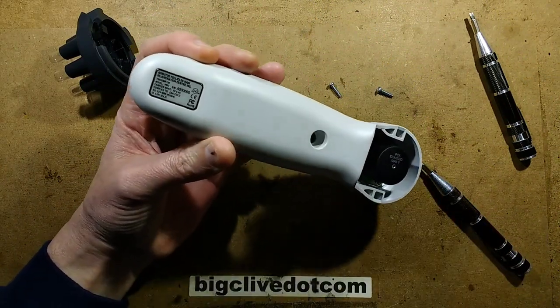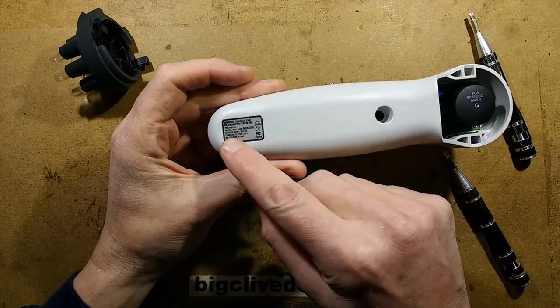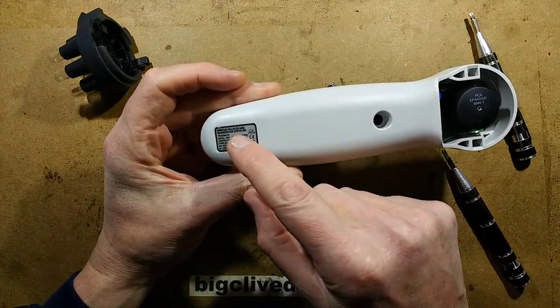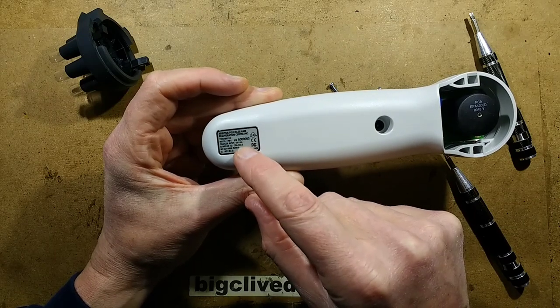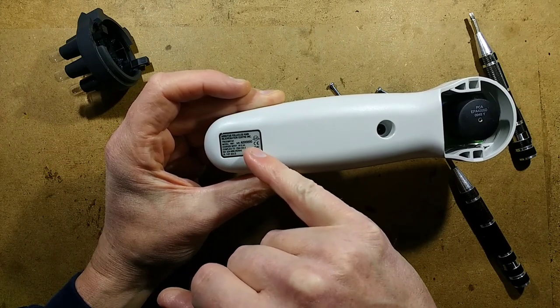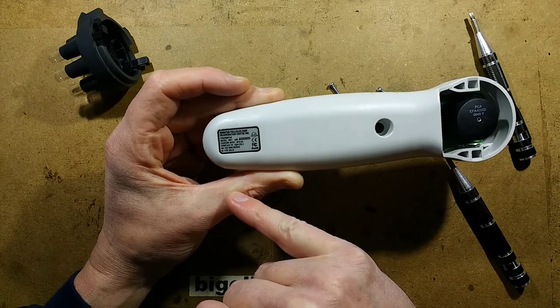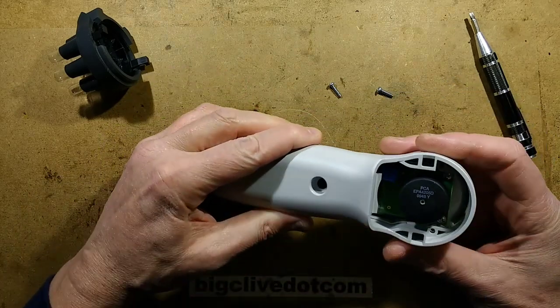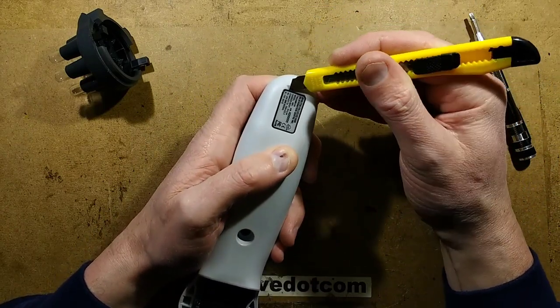I should actually read this label - I should put my reading glasses on. It says: Arabitus Follicles Hair Rejuvenation Centre Inc. Trioxinator Model HM1, Serial Number A0000. This isn't the first one, is it? Maybe they just didn't bother putting a proper serial number on it. This is rechargeable by the way, which is unusual.